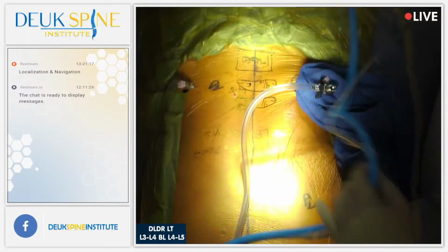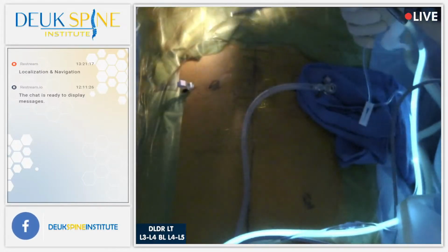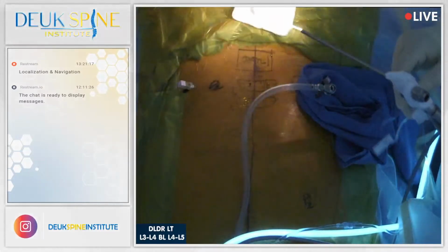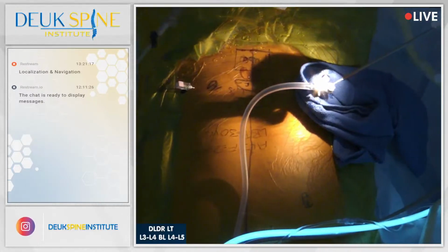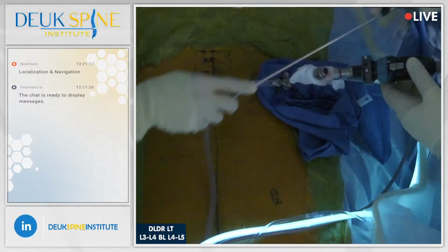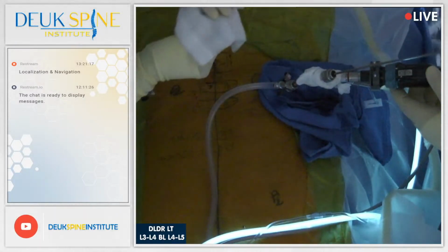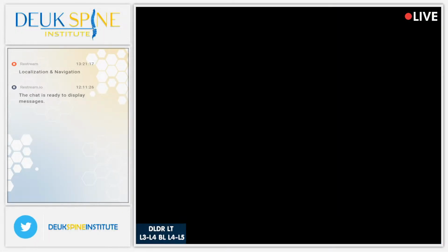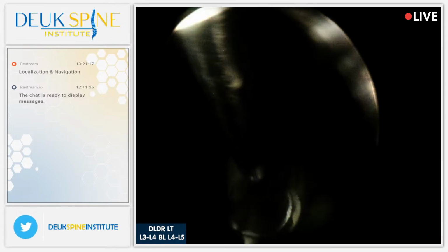With more traditional spine surgery like laminectomy, discectomy, the surgeon uses more radiation, especially with fusion surgery, where there's so much radiation used during the placement of the implants. So it's a much safer surgery doing the endoscopic for many reasons. No bleeding, no postoperative pain from the surgery itself, and minimal to no radiation.